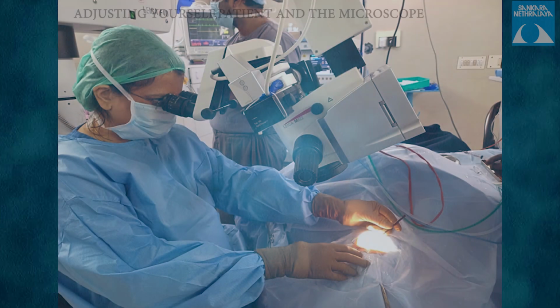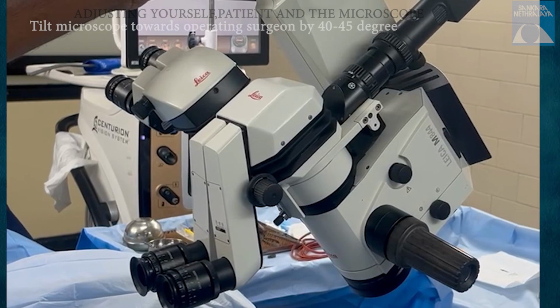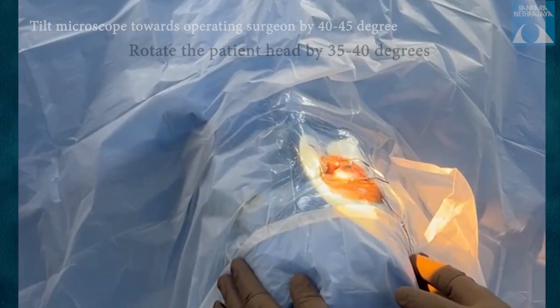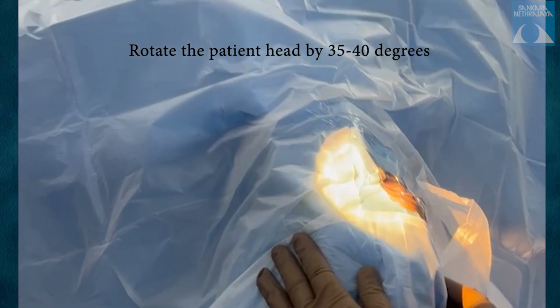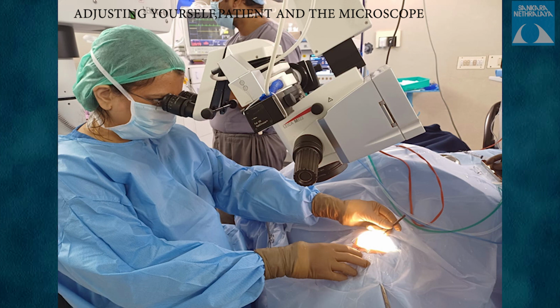The surgeon sits temporally to the patient. This is a case where the surgeon is going to perform Kahook Dual Blade goniotomy. The microscope is tilted 40 to 45 degrees towards the surgeon and the patient's head is rotated 35 to 40 degrees away. With this, the working distance between the surgeon and the surgical site increases.